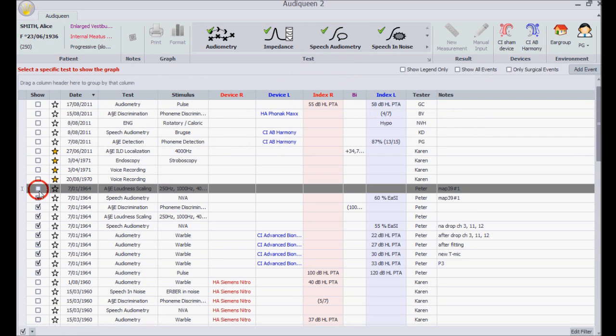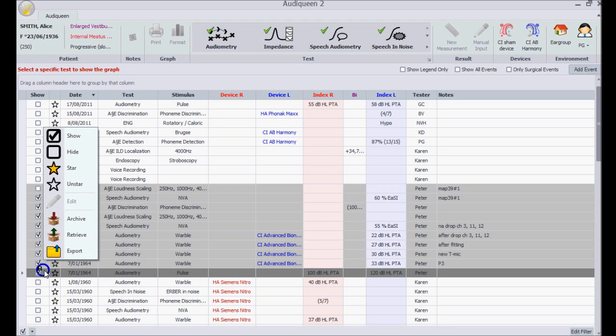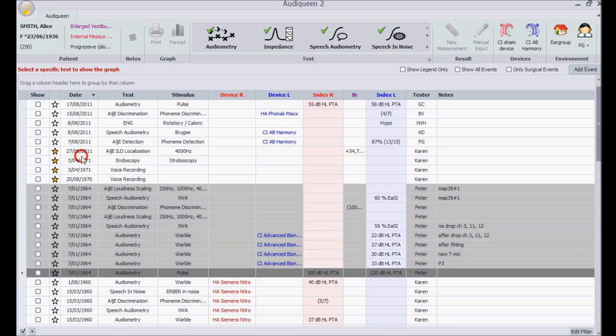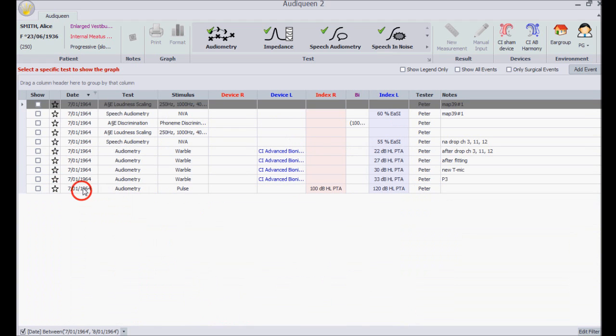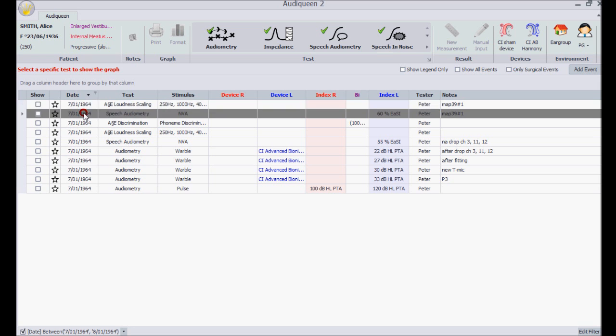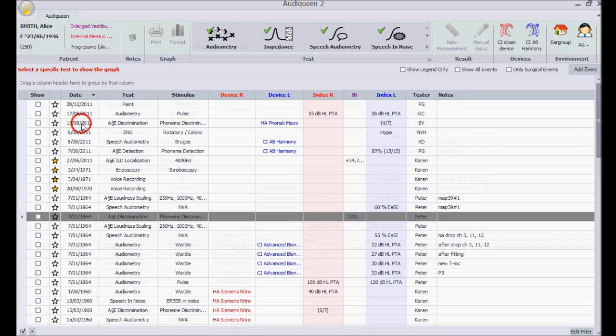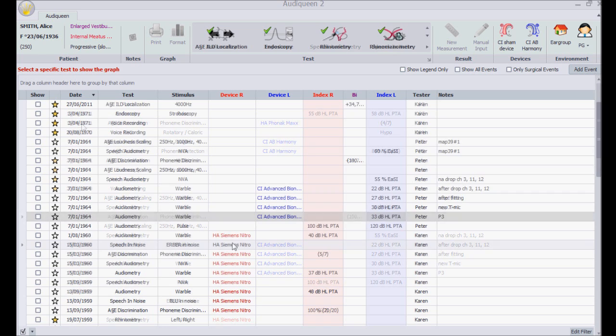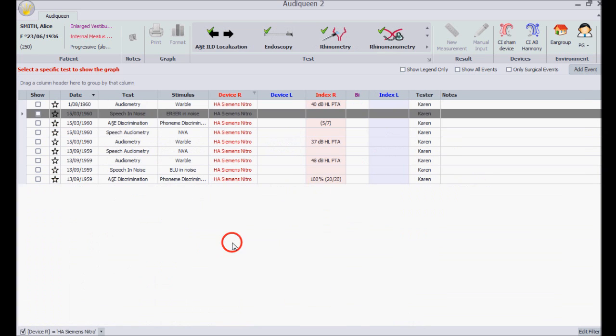I uncheck these results and remove the filter by double clicking once again. This is possible with all fields.